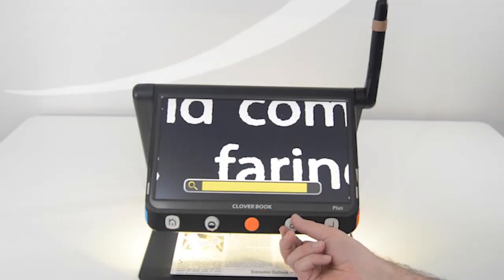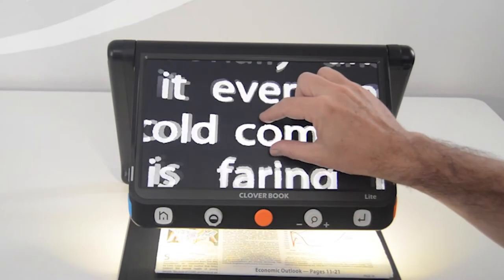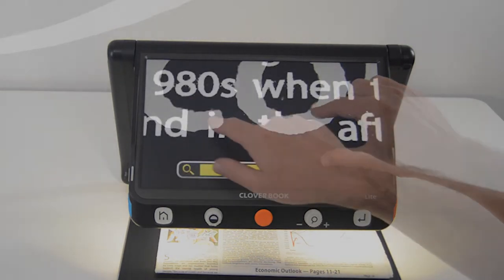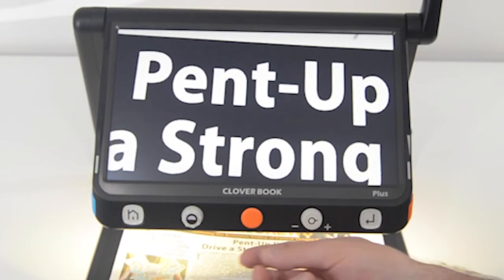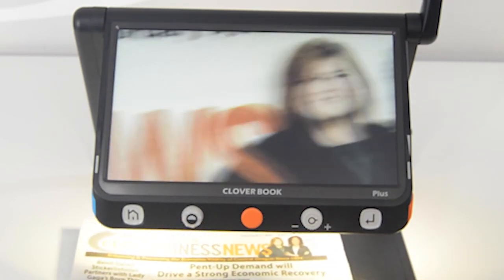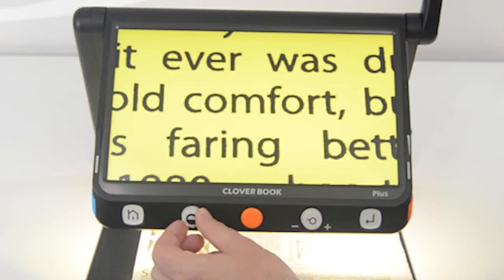You can increase and decrease magnification and do live panning with the tactile controls. Or use the touchscreen to pinch and zoom and pan around the live image, simply by pressing your finger on the screen and moving to your desired location. If you want to change the contrast, you can push the button on the contrast knob to quickly move between your favorite contrast and full color, or turn the contrast knob to move between the various color choices.